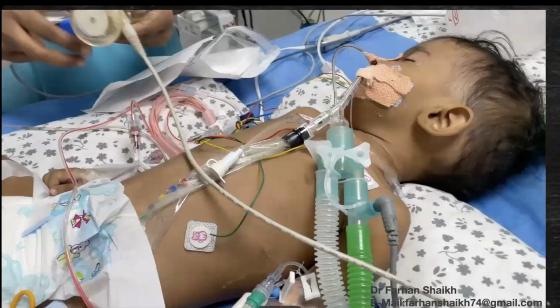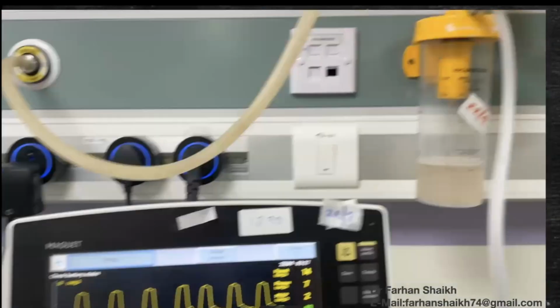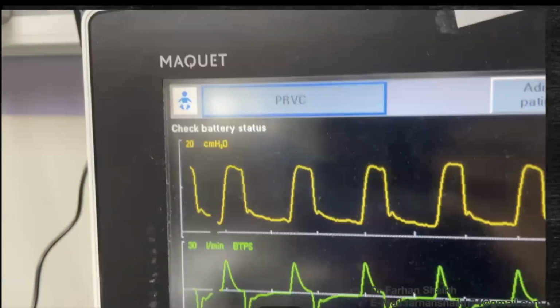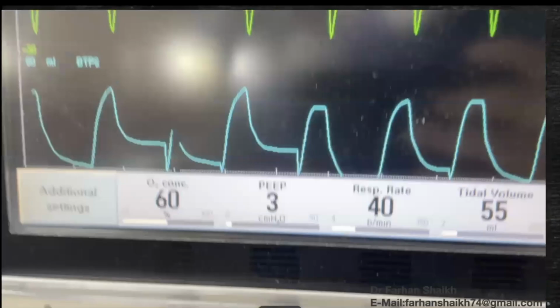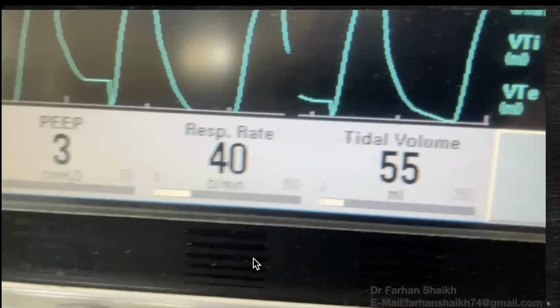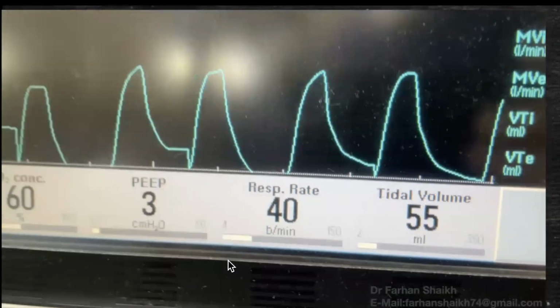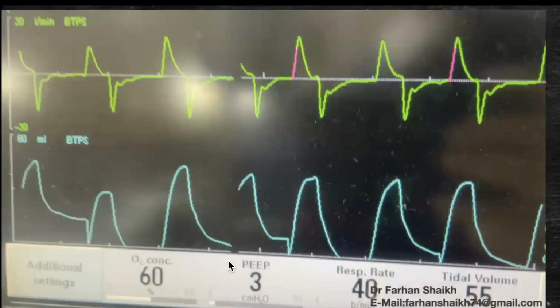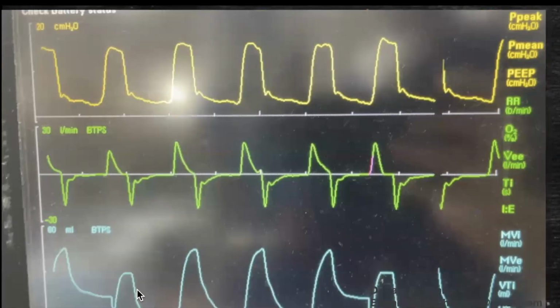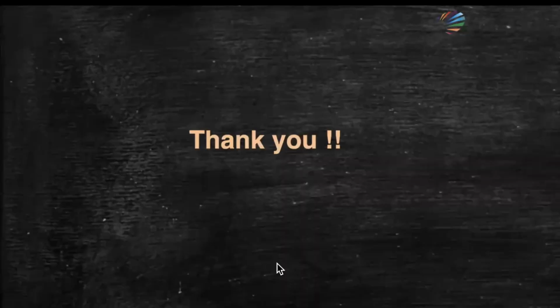And then we look at the patient now and see the patient is breathing comfortably, all asynchrony is removed, and all the graphs are good now on PRVC. So this is what I'm trying to say: it's so important to understand pulmonary graphics. Although we have not yet discussed patient ventilator asynchrony, in some other lecture we will discuss it also, to understand further the usefulness of pulmonary graphics.